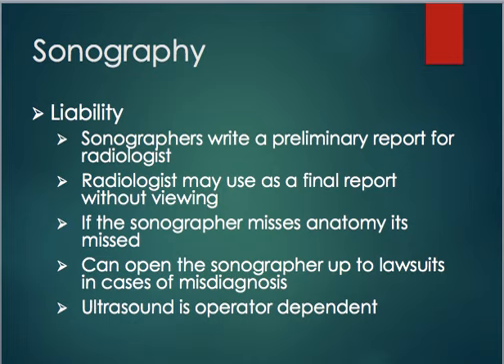It's easier to make sure that everything's 100% included. We can't share any information with the patient. We tell the patient the radiologist is going to read it, and we go about our business. With ultrasound, if they don't scan or record an area of interest, then it's missed. The radiologist can't go back and look at it later unless the patient's called back and rescanned.